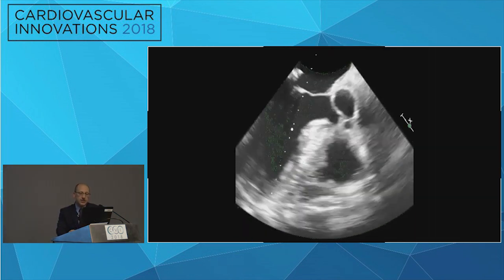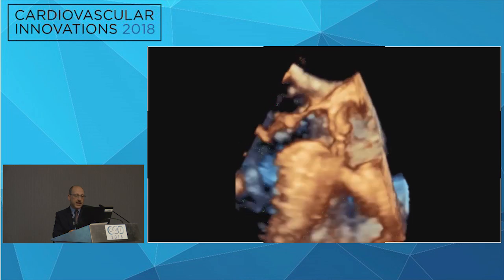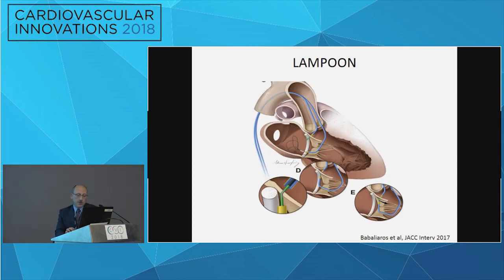This is one of the cases, and as you can see here, some septal hypertrophy, and you can see the anterior leaflet at the end of this simultaneous echo run will actually oppose to that hypertrophied portion of the myocardium. So a couple of theoretical approaches have been proposed.